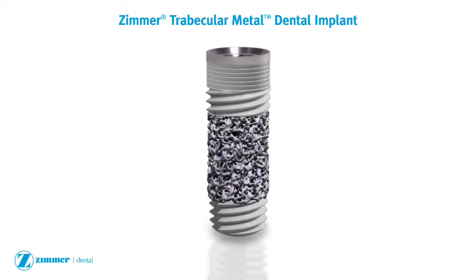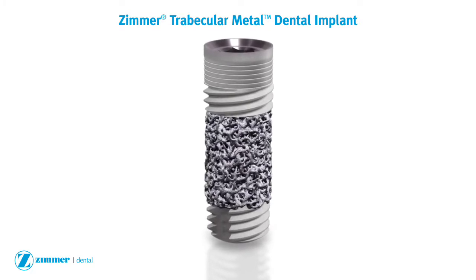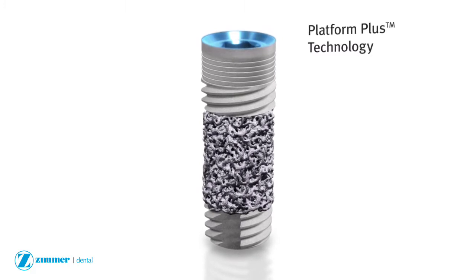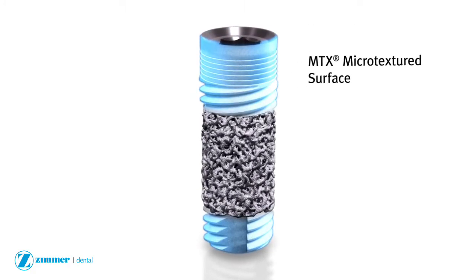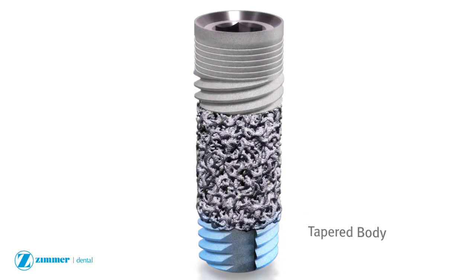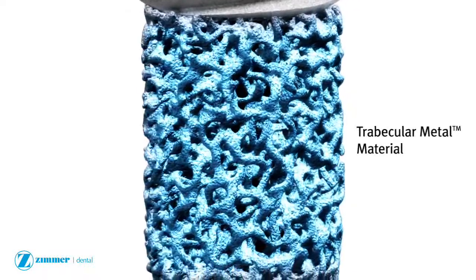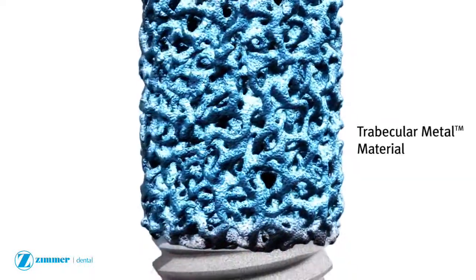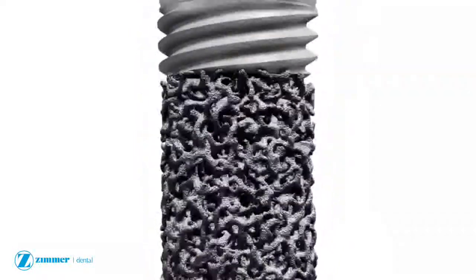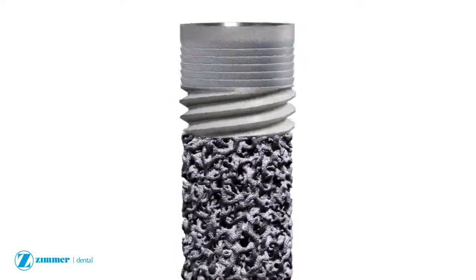The Zimmer trabecular metal dental implant combines the unique properties of trabecular metal material with the popular features of the tapered screw vent implant. The implant's trabecular metal midsection is encompassed by a titanium alloy body and core, providing the strength and geometry of traditional dental implants. Coronal micro grooves with optional MTX micro texturing to the top is also available.